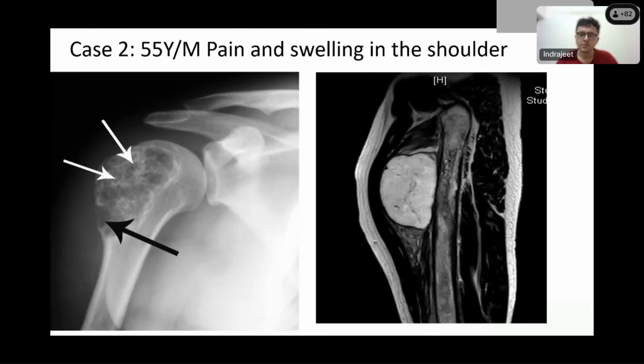And then, of course, this MR, which is on the right, is a surprise because it's not completely matching what I see on the X-ray. It's showing a huge lesion on the surface, a big soft tissue component, which I couldn't appreciate on the X-ray. I can see an intact cortex, and I'm not quite sure if that marrow within is a continuation, because you see a very bright T2 bright lesion, which is all cartilaginous on the surface, and some dark areas within the marrow.